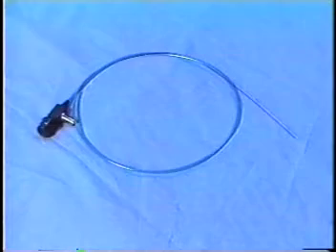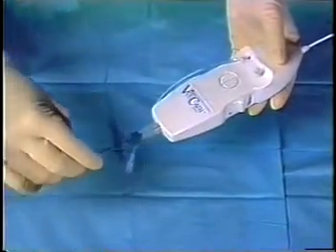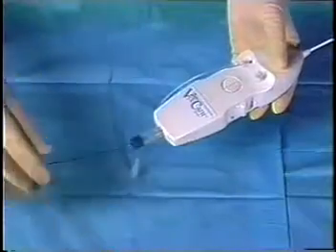Medications can be injected through the catheter directly into a specific spinal nerve. During spinal endoscopy, a very thin fiber optic endoscope, about the diameter of a pencil lead, is placed into the spinal canal using a steerable catheter.